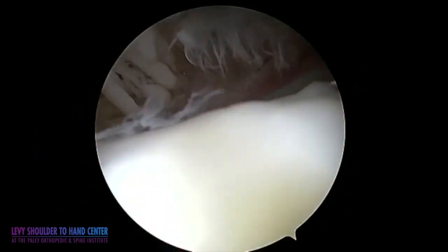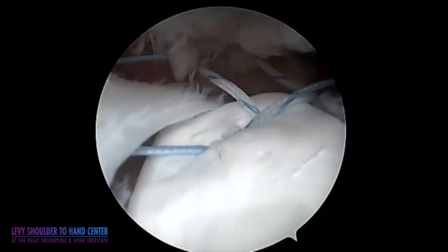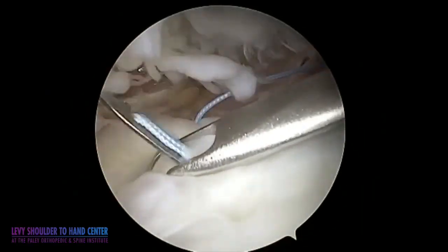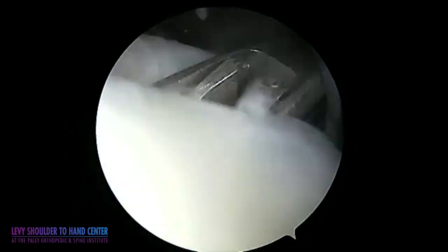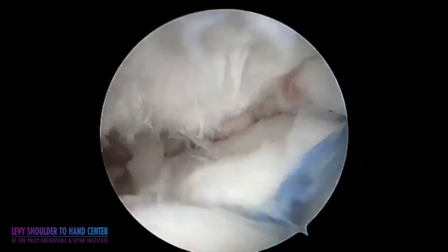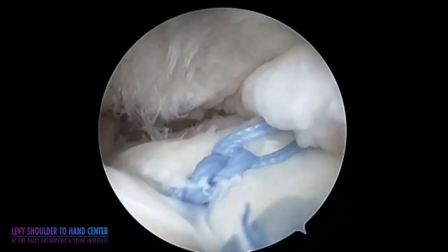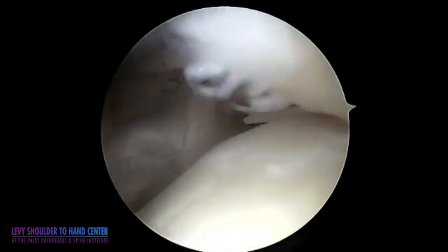So here you can see a retrograde placement of each of the sutures. And in this case, you'll see a series of horizontal mattress sutures, which will be used to repair the rotator cuff in a sequential way. Once all the sutures have been passed, I like to tie my medial row. Here you can see the remainder of the knots have been done, creating a strong medial row fixation, and a lateral row series of anchors will then be placed.